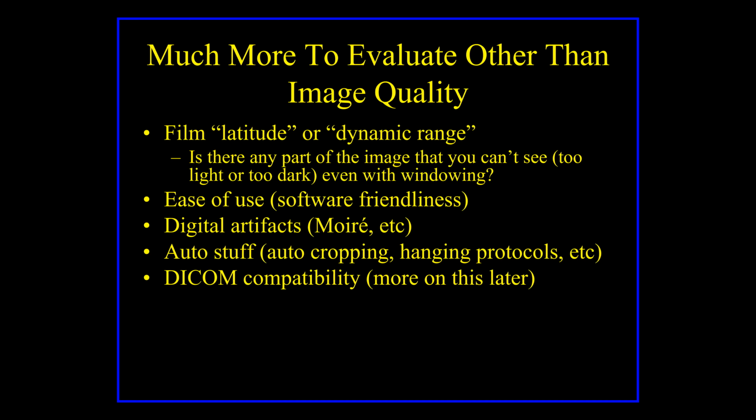Okay, DICOM compatibility. We want to make sure that the machine that you have is fully DICOM compliant. And we're going to talk a little bit more detail about what DICOM is. Have y'all heard the term DICOM? Okay, well, some of you maybe have. It's a very common term that if you're introduced to it now, it's not going to be the last time you're going to hear that acronym, which we'll talk about a little bit more.